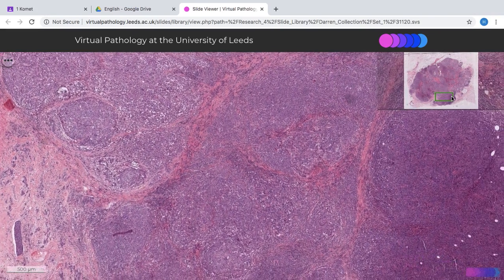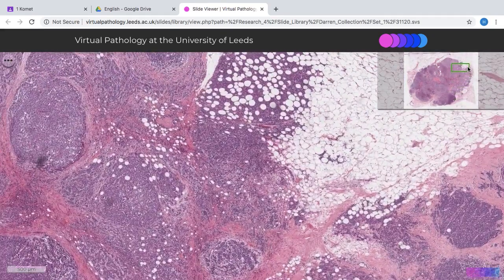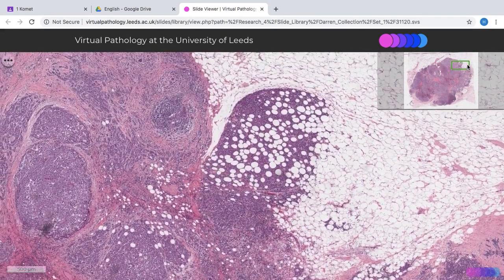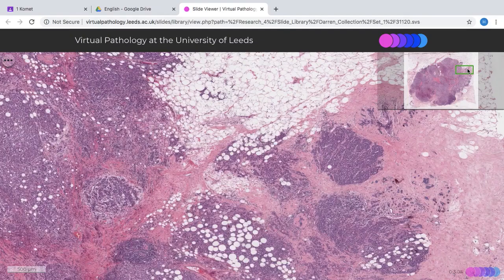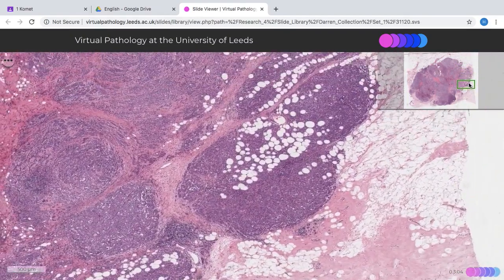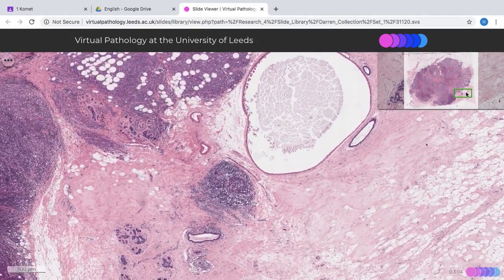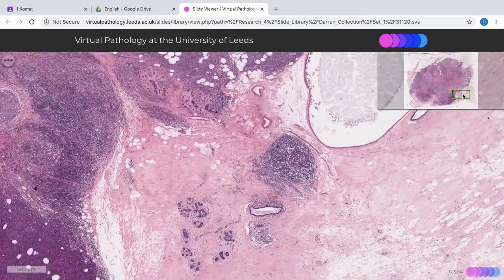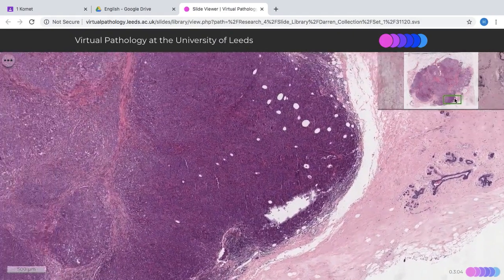You can see that this tumor is quite irregular, and in areas we can see the infiltrative border going into the adjacent fat. Here you can see tumor going into fat and we have some residual benign breast parenchyma adjacent to it as well.